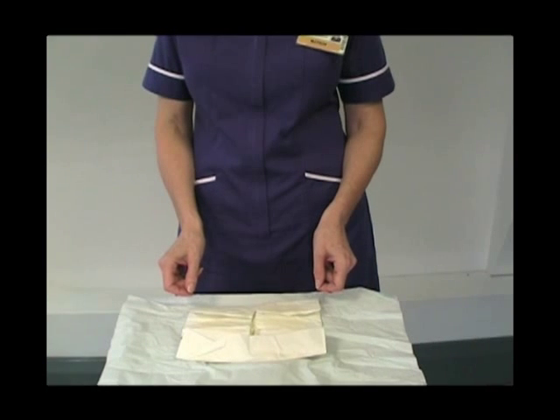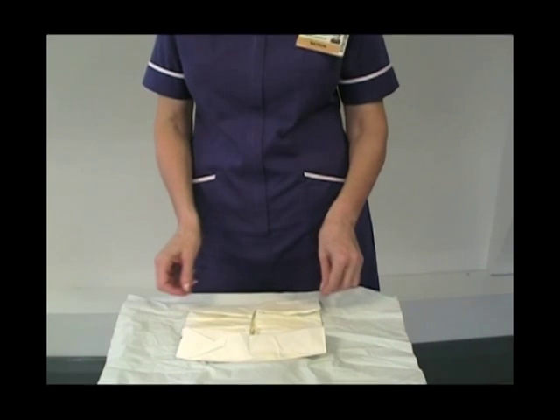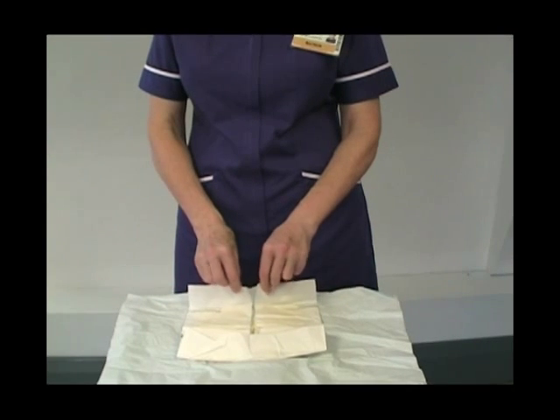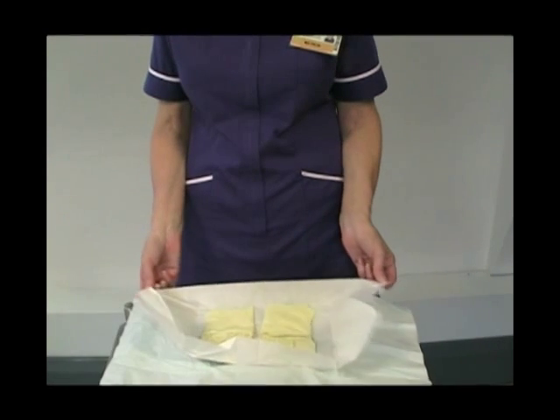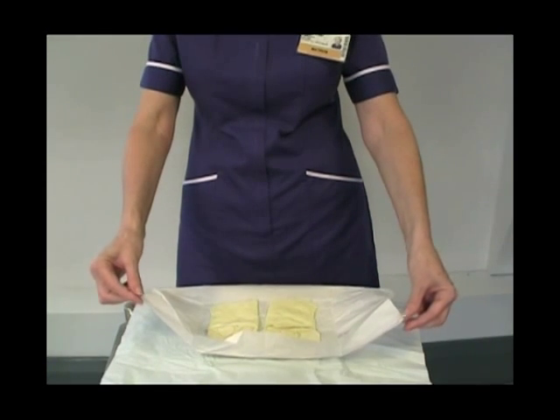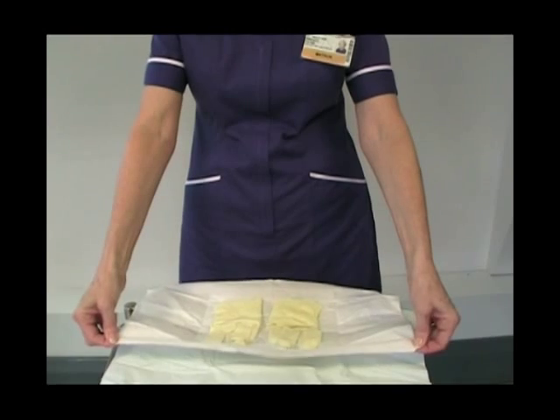To put on your sterile gloves, open the pack as I've done here, touching only the edges of the paper. Open the pack and flatten it out.